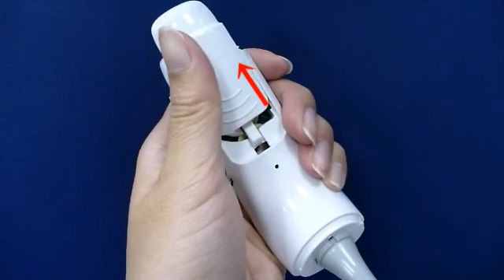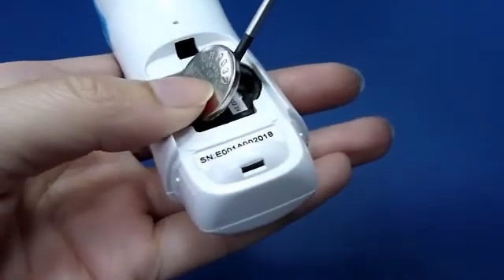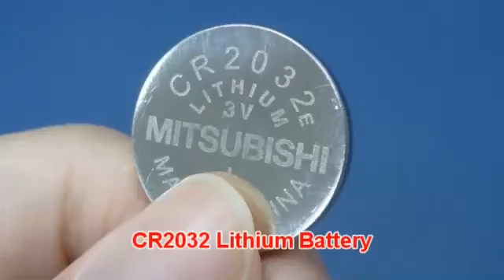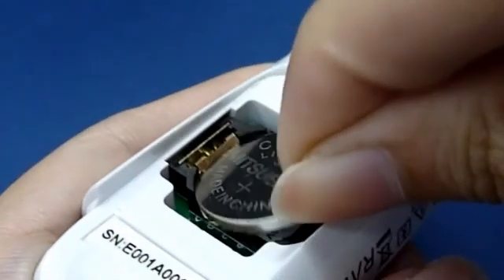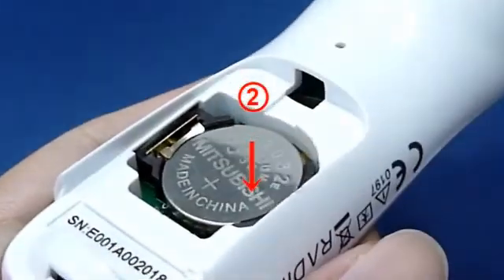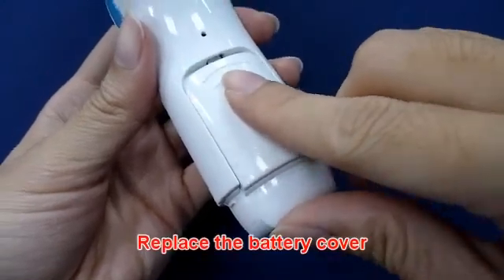Use your thumb to push the battery cover out. Hold the device and flip the battery out with a small screwdriver. Insert the new battery under the metal hook on the left side, then press the right side of the battery down until you hear a click sound. Replace the battery cover.